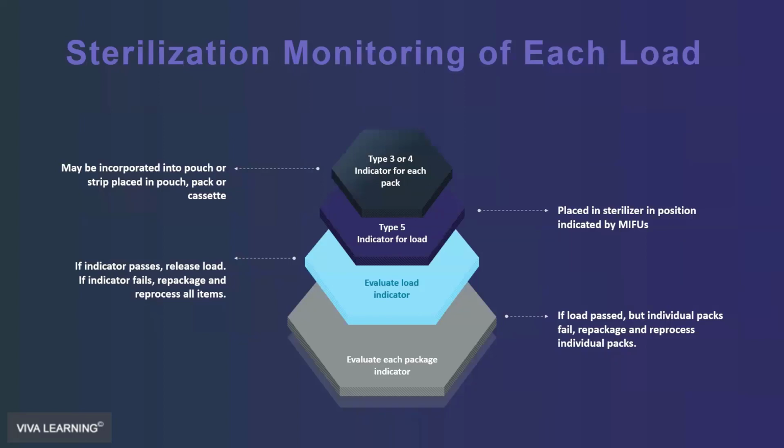After you do your monthly cleaning of the autoclave and have emptied and refilled it, do you need to run a test? I think you mean a spore test, or just run a cycle to make sure you follow the manufacturer's instructions. There isn't a need to spore test after cleaning, but the manufacturer's instructions say maybe run a cycle after you've cleaned it.